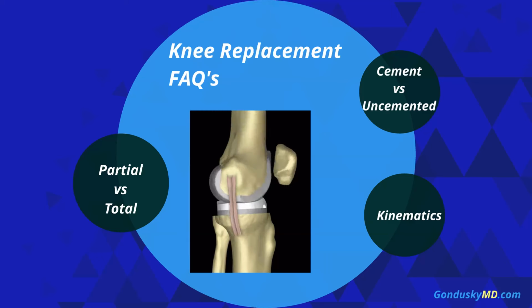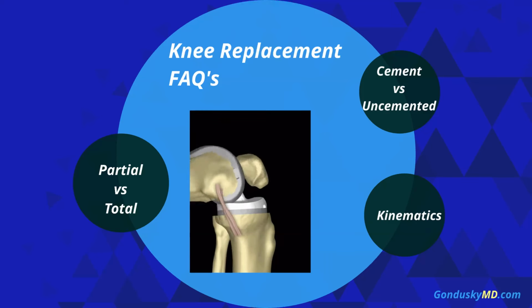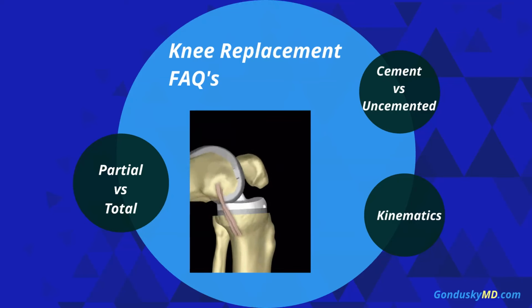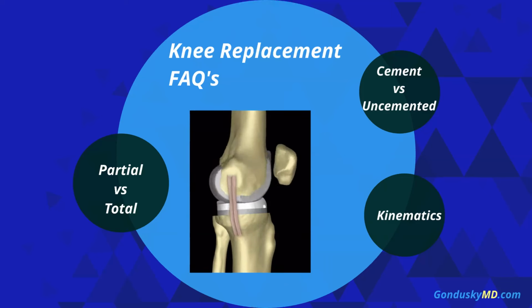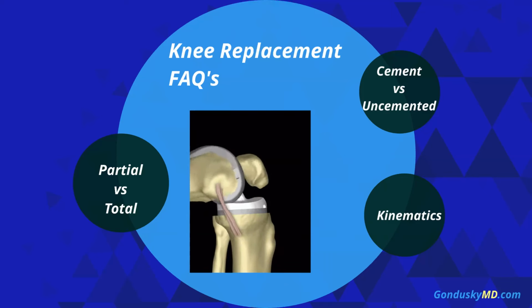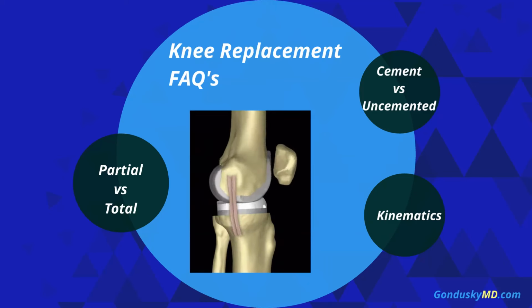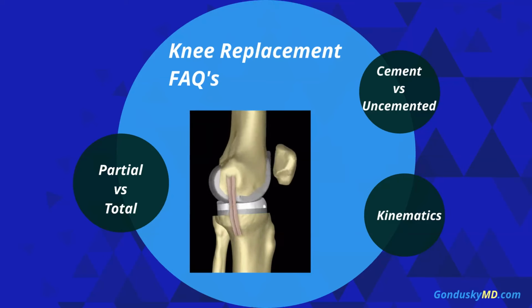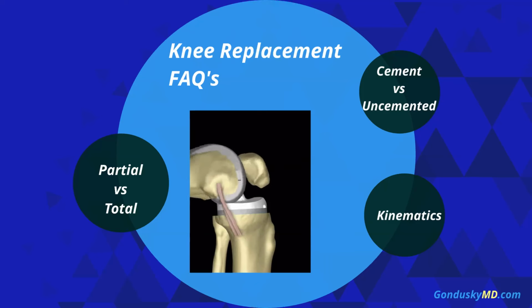In the middle of the knee, there's the ACL and the PCL, in which case the ACL goes away in all total knee replacements, and the PCL stays in most of the total knee replacements that I do, but you can keep or take the PCL depending on what kind of components you're going to use, and that provides the front to back stability. But otherwise, the quadriceps tendon, the patellar tendon, the medial collateral ligament, the lateral collateral ligament, all those surrounding soft tissue structures we rely on for stability because we want that knee to act just like your normal knee, and so those ligaments stay intact.